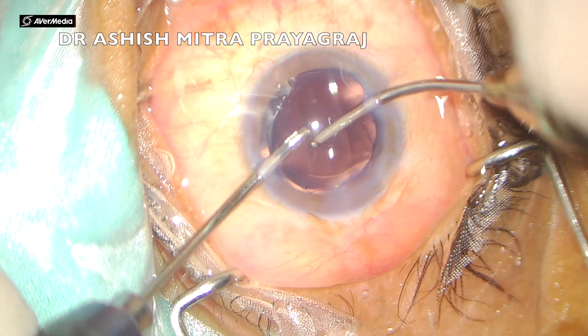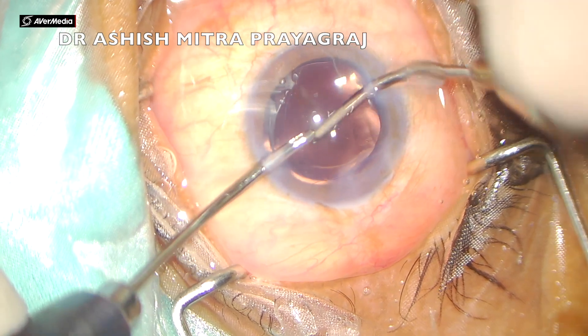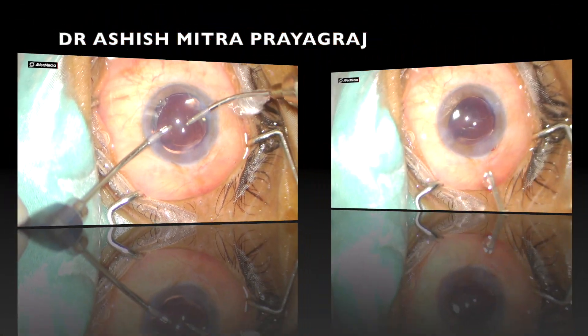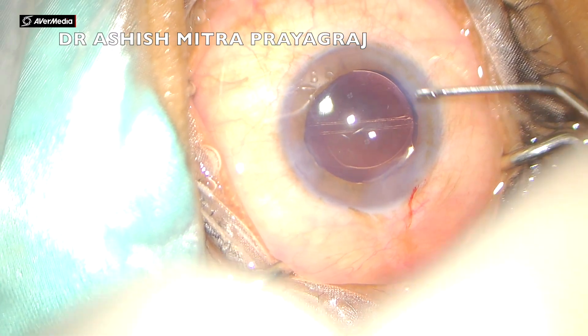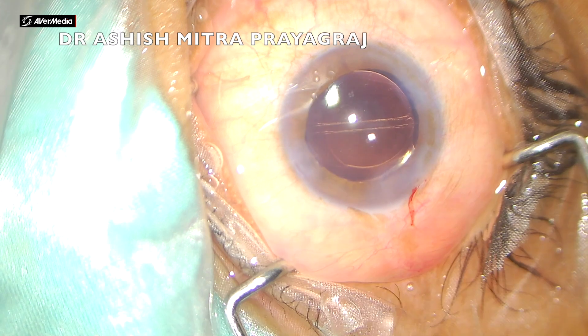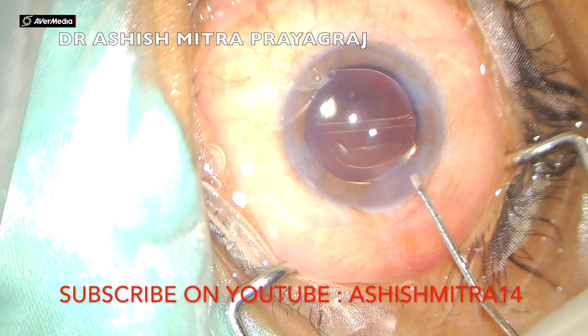Now IOL implantation — I am doing it under saline, and it makes the job pretty easy. You can see how easily it was done: the leading haptic went into the bag and the trailing haptic was just depressed into the bag. Finally, closure of the wounds, and you can see the IOL is well in the bag.